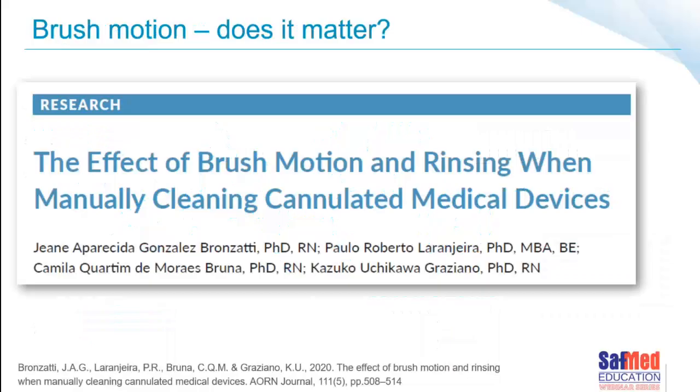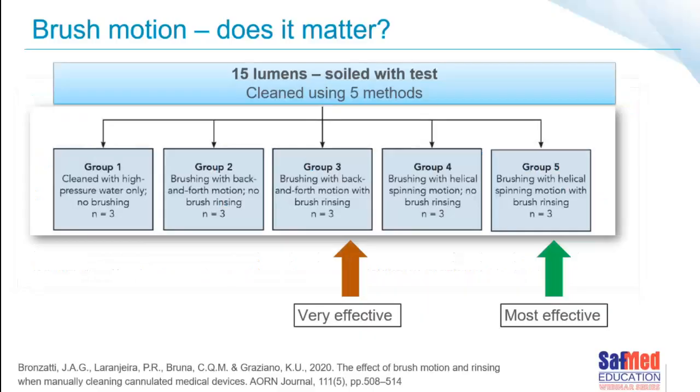Now, what about brush motion? So we had seen in that one set of IFUs where they clearly said use a spinning or a rotating type motion when you're cleaning with the brush. Here's some research performed and published in the Association of Operating Room Nurses Journal, looking at the effect of the actual brush motion and rinsing when cleaning cannulated medical devices. For this research, they took 15 lumens, they soiled them with a particular test soil, and they used 5 different cleaning methods. In group 1, they cleaned using high-pressure water only, so no brushing.